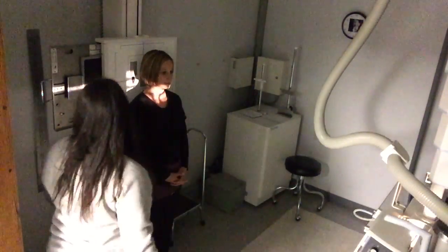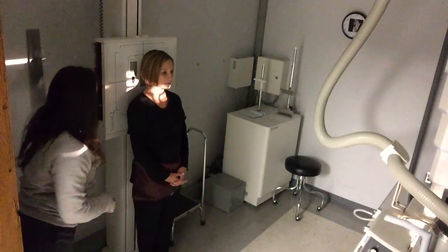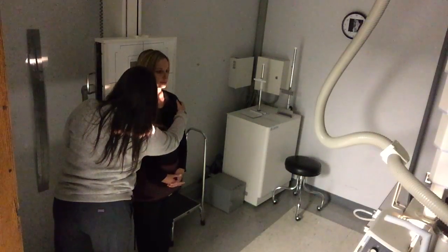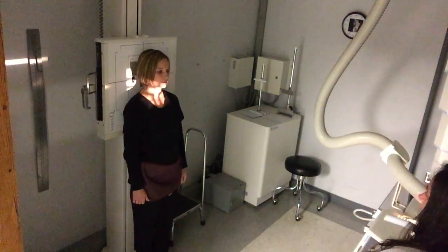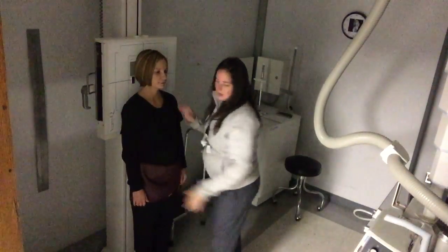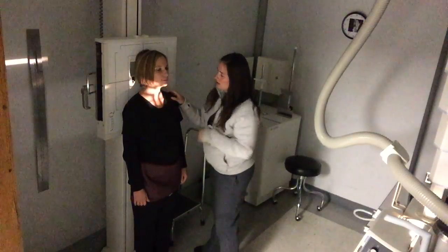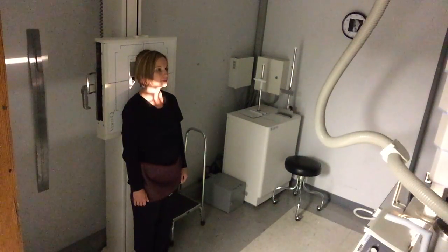I'm looking at the IR here to make sure that my central ray is in the middle of that. I'm going to scoot her over just a little bit so that my central ray is right down the midline of her body. I'm leaving my right marker. I'm going to collimate down a little bit closer side to side. Then the last thing I'm going to do is position her head, since patients can wobble and move — so we want to do that at the very end. I'll have her raise her chin up. This is the same 85 KVP technique, and I typically have them do an expiration, but they just need to suspend their breathing and you can expose.